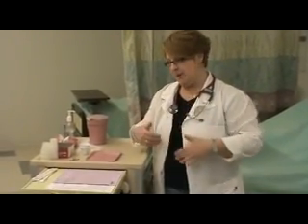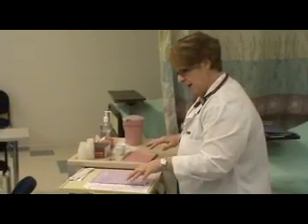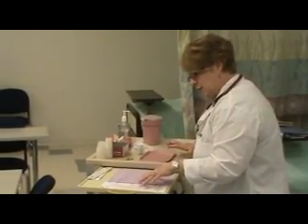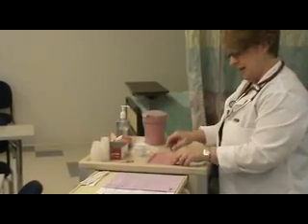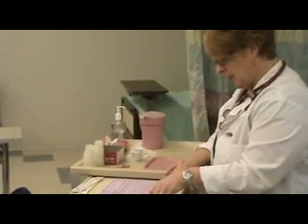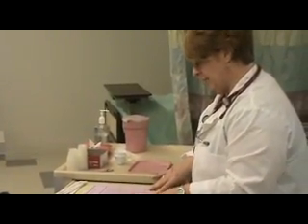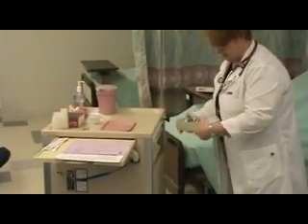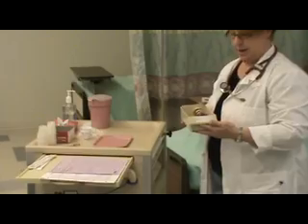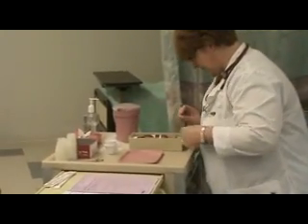So now, here I am at the med cart with my MAR, my cups, my tray, and I've got water for diluting the medications. So now I'm ready to pull the medications. Remember, I'm dealing with Mr. Francois Baptiste. I've pulled his tray. I'm going to take a look at what I need.